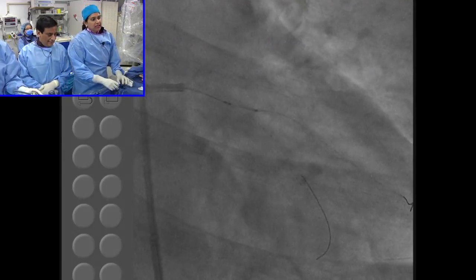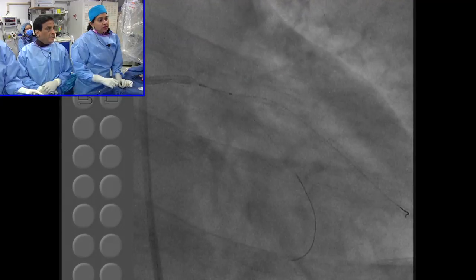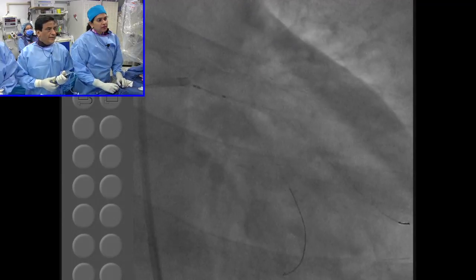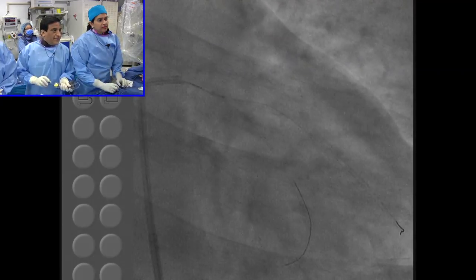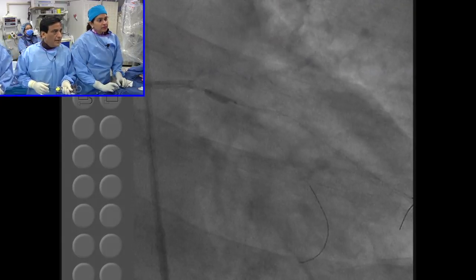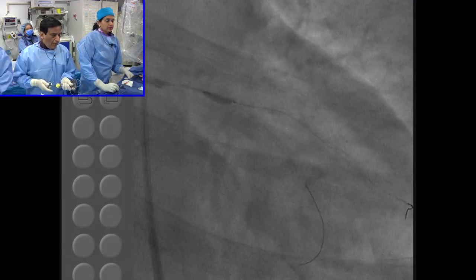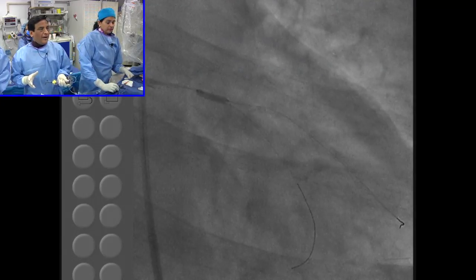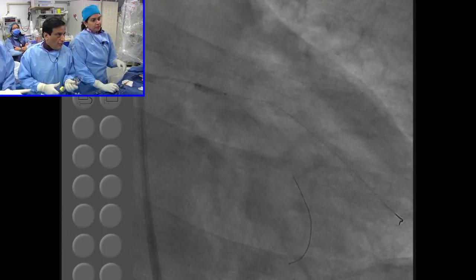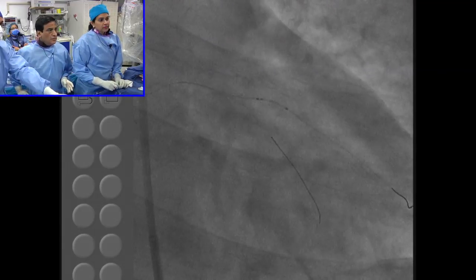Samin, to me, the advantage, look, is that this grips the lesion a little better, doesn't it? No, definitely. But I mean, it's the same way like all the atherectomy balloons do. But the question here is that it is supposed to cause less dissection, but there is no comparison that you have compared this chocolate balloon with a plain balloon. Right. But the idea there is what can you do, particularly in cases where you don't want to put a stent. I think that will be one good advantage of this device, and particularly let's say side branch. You don't want to put a stent in the side branch. But definitely there will be less slippage.